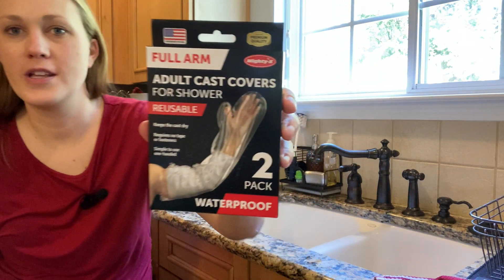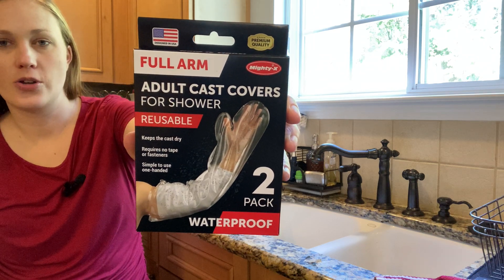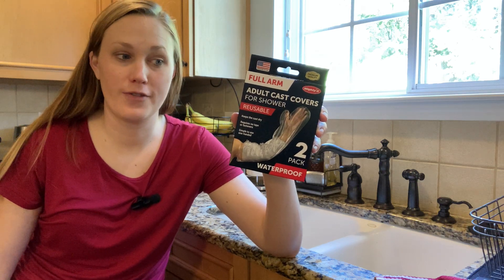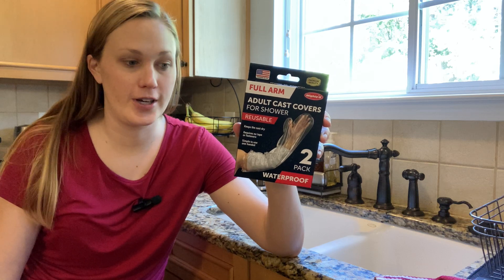I'm here today to go over with you these arm covers. They're cast covers for the shower. The company did send me these for free to review, and I have not used them yet, so we're going to do this together for the first time and you will get my honest review. You'll get to see for yourself if they work out of the box or not.